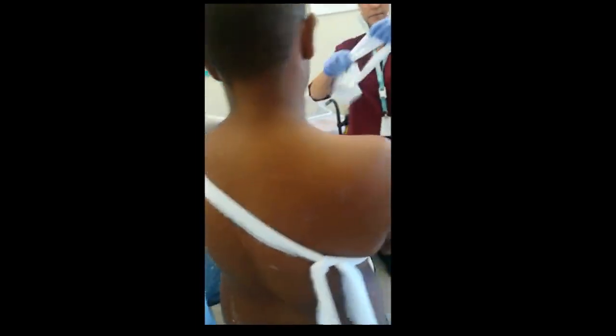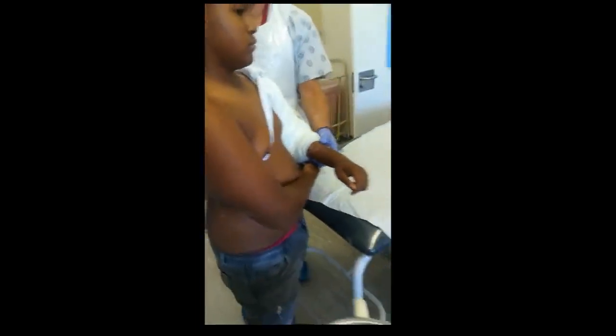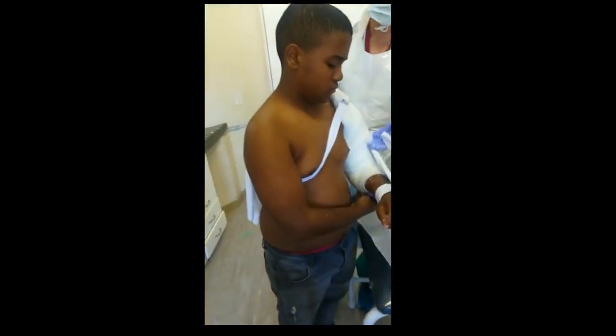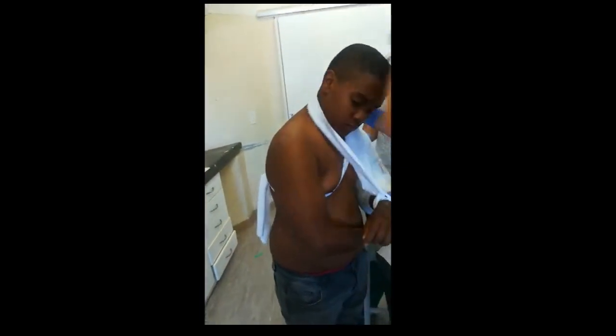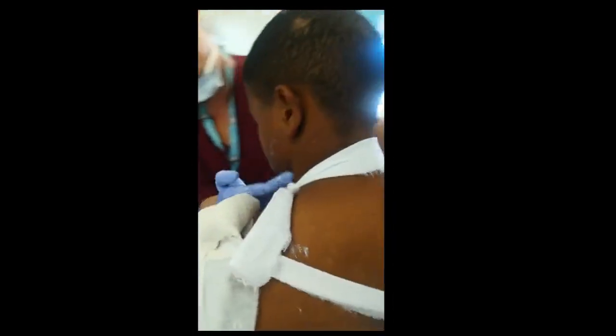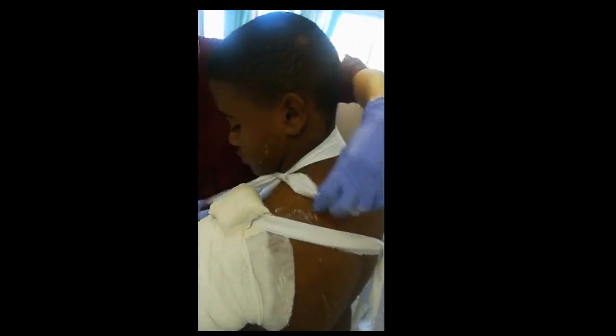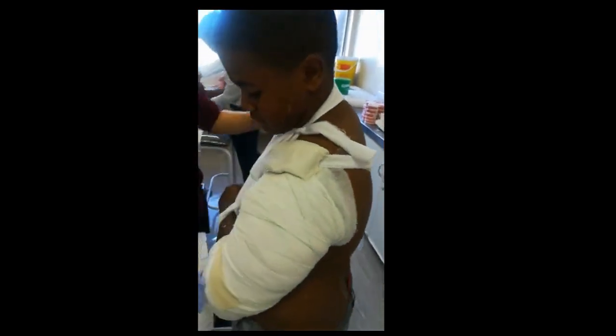Then the second sling is put around the wrist like this, and this is to support the patient's wrist. The knot needs to be on the side of the neck, not at the back, because it becomes irritating to the patient and they can get contact dermatitis. And there you go — U-slab applied.